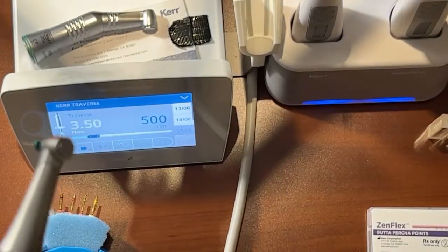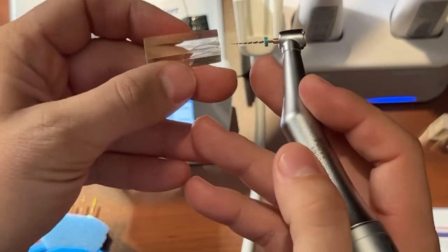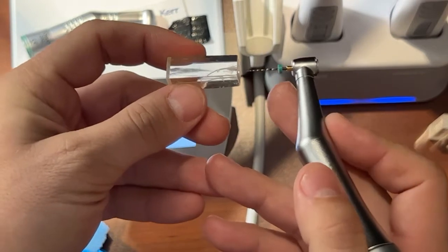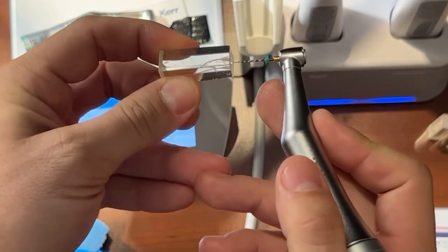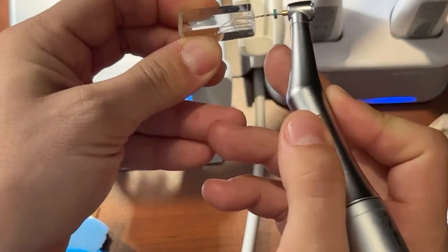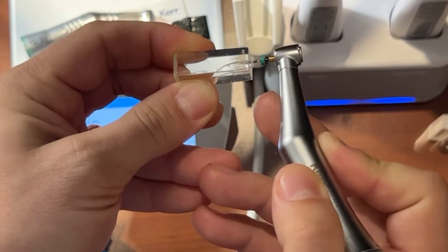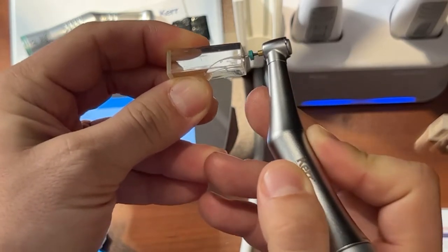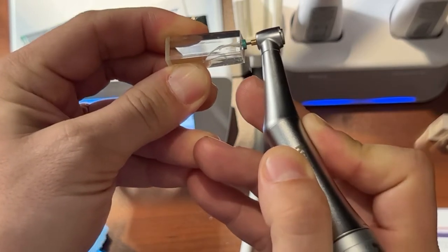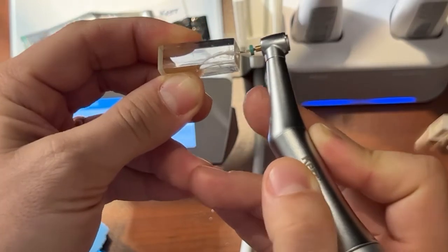I'll use the foot pedal here, and what you can see, if I don't stab myself, is I'm going to start to shape the canal. So I'm coming in, and it's starting to just open that orifice for us. And we're just opening the orifice.